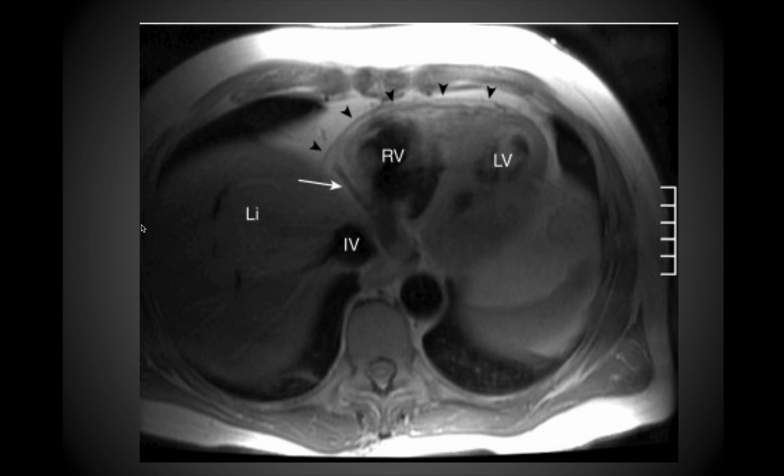Cardiac MR and CT imaging. So we're going to start out with some cardiac MR imaging. And I just wanted to point out that cardiac MR imaging is very, very new. It's just been developed in the last several years, primarily in the last 5 years is when it's been rolled out clinically and been very, very useful.